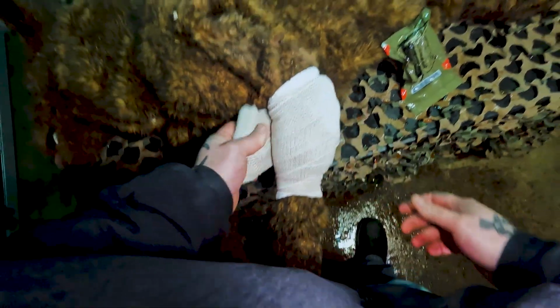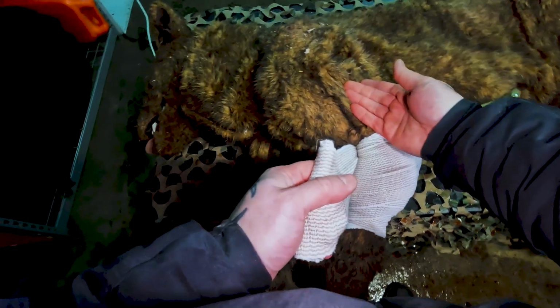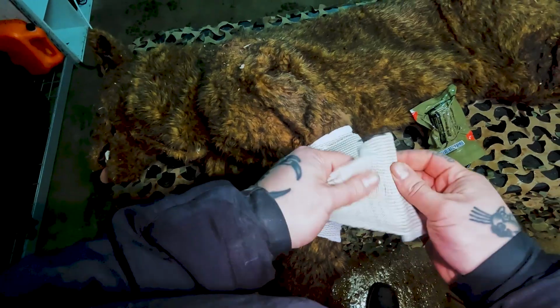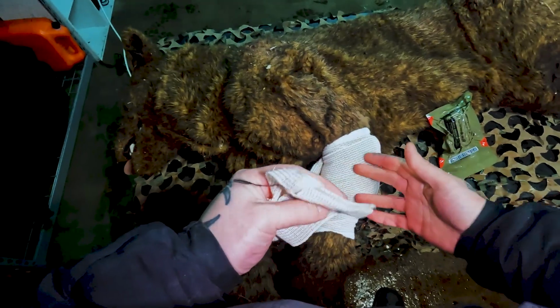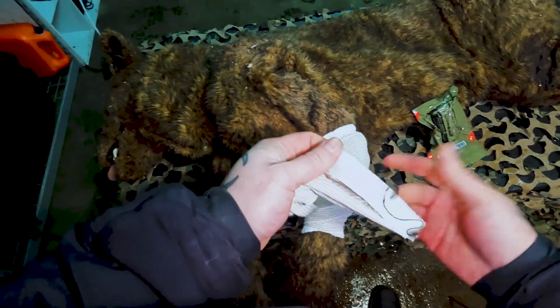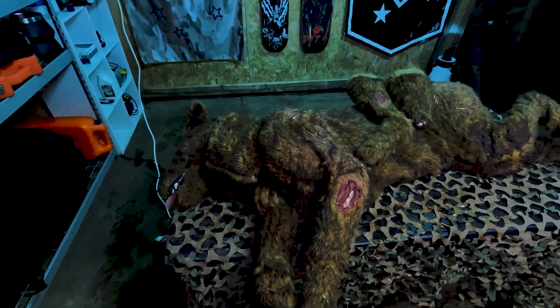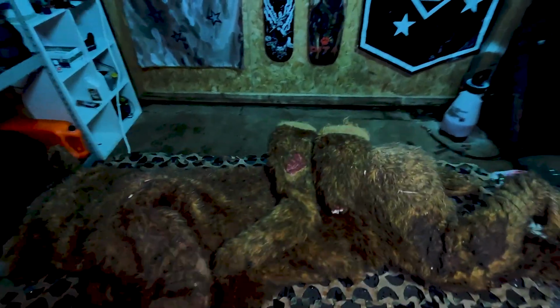You can watch me keep wrapping this, but you're going to end it the same way as every other high and tight tourniquet or pressure dressing bandage. You can tuck it. They do have Velcro on the end, but you want to make sure that this doesn't move or come loose or undone every time you move them or they move. A lot of the times, if you just have it secured with the Velcro, it's going to fail and come flying off. So dealing just with canine extremities, the principles of bandaging and being a compressible injury are the same, whether it's the front leg, back leg, or their tail.